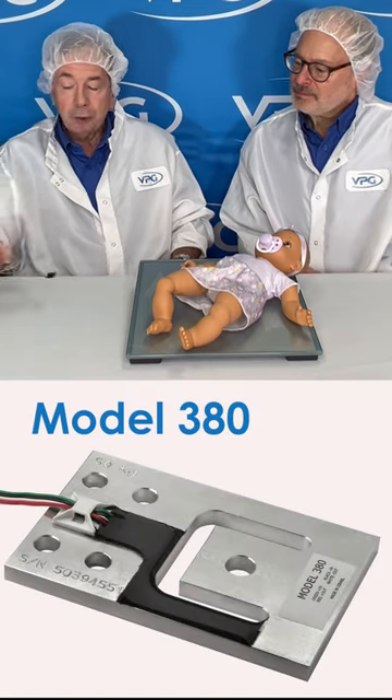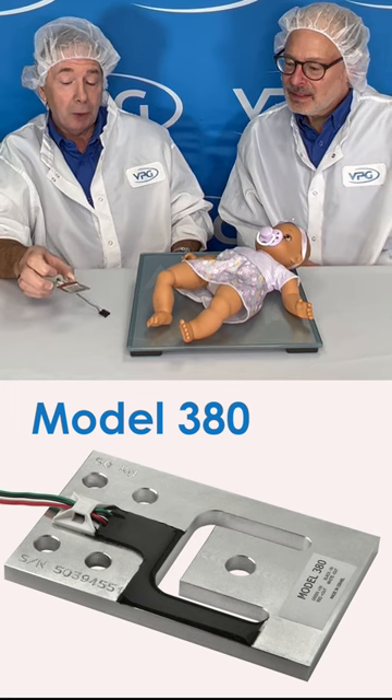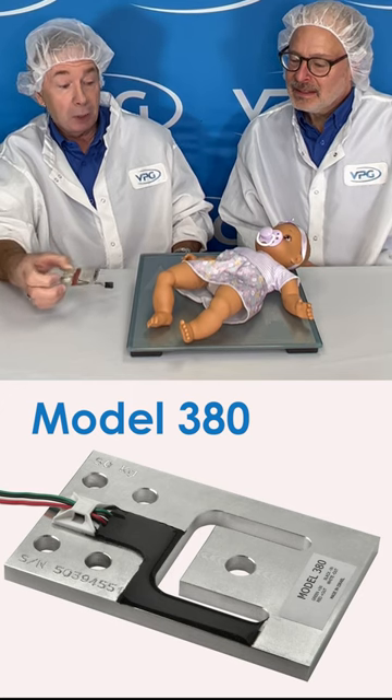We have the Model 380, which is a perfect load cell for an incubator. It's very small, a perfect design for it. You can put one in each corner — very thin, low profile — and it's perfect for an incubator.